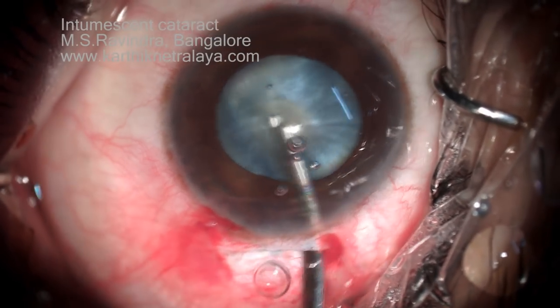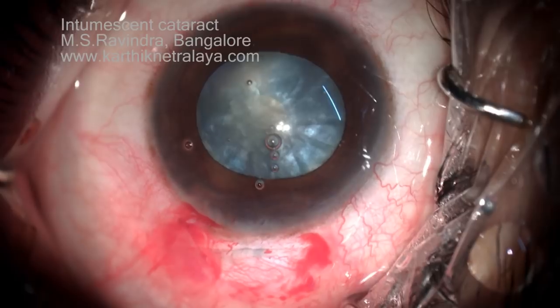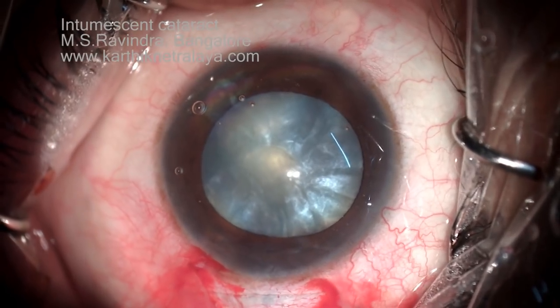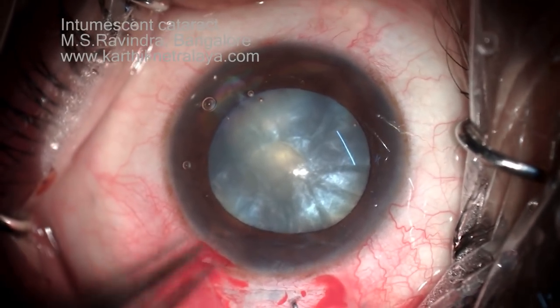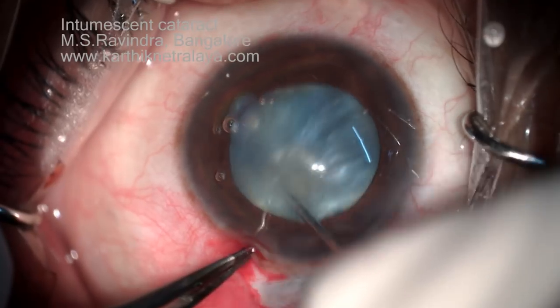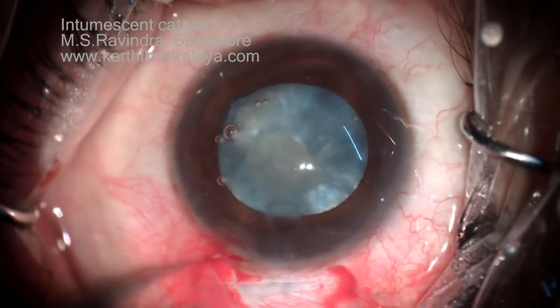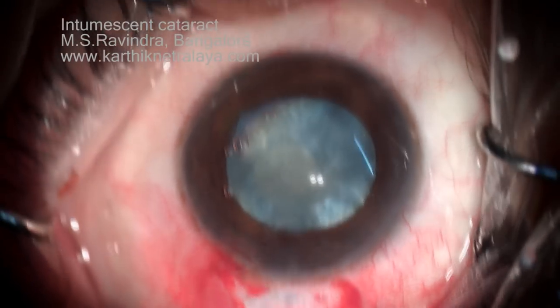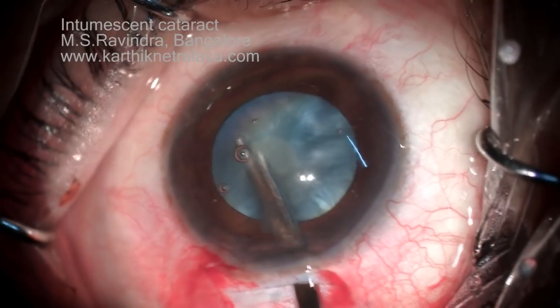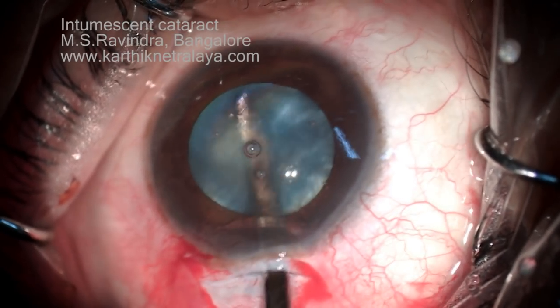I would like to remove the maximum amount of cortex, especially in the periphery and mid-periphery part of the lens, which offers maximum force for the rhexis to run off. With the long Sinsky hook, the lens is rotated inside the capsular bag, and the cortical matter is churned with the same instrument and aspirated. Depending on how dense the material is, sometimes it comes out easily, but in this case it is more challenging and time-consuming to go to every particular quadrant to remove as much material as possible.